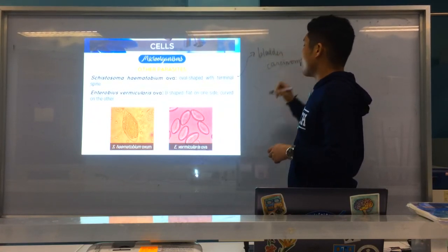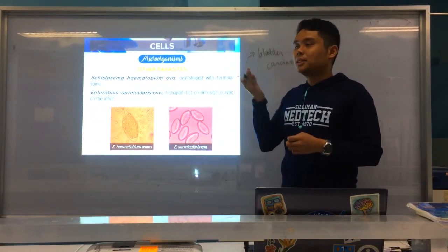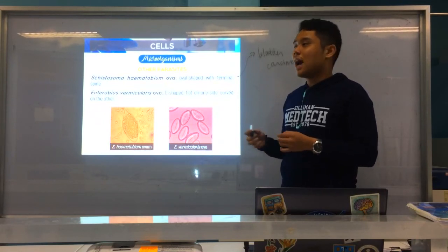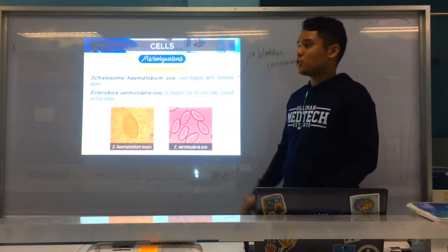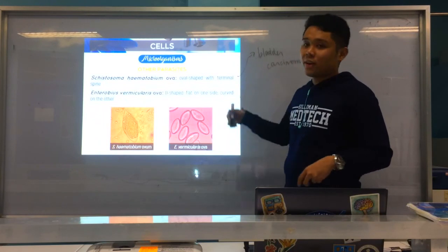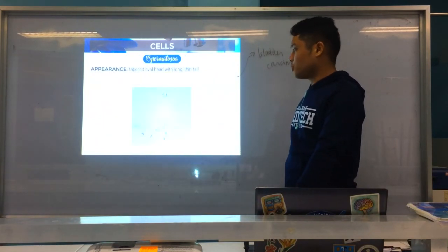Okay, bladder carcinoma. Okay, because again of iyang spine, it could damage your mga cells. Okay, munang usually if nakay schistosoma hematobium infection ay mga hematuria, because of iyang spine damage. And furthermore, if padayon ang infection, it can cause bladder carcinoma. Okay, and the last type of cells that is here is spermatozoa.